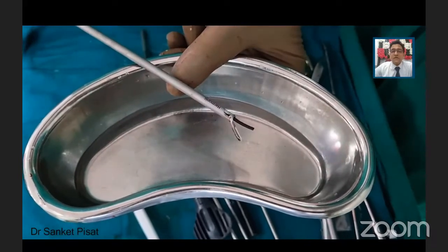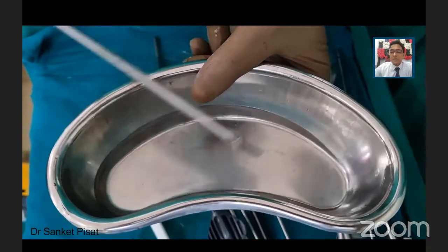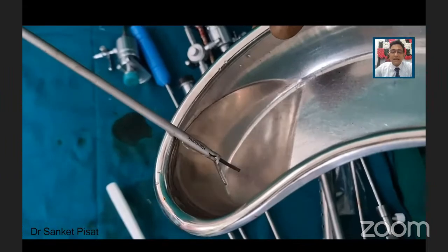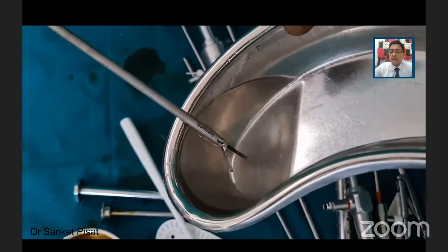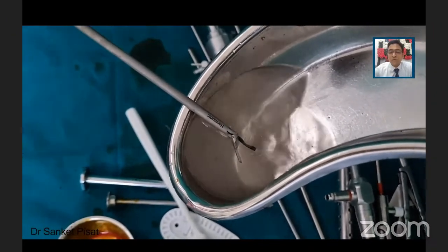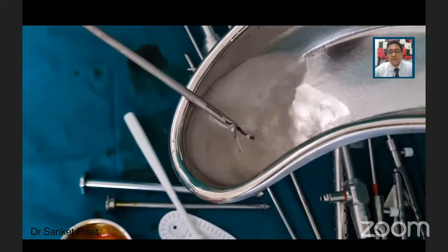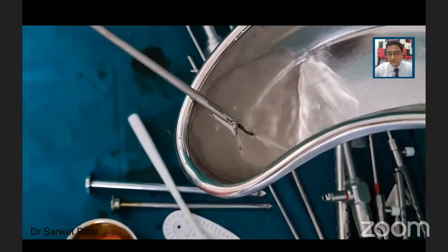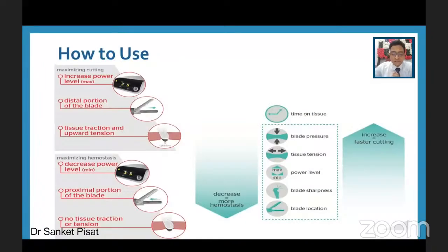Though this is not visible to the naked eye, you can see that I have started the ultrasonic scalpel, but the black blade is not seen to move. However, when this is dipped in water and the machine is activated, you can see that there is a sharp burst or a sharp jet of water which starts moving just because of the displacement, and in the maximum mode this displacement is even more, almost forming an aerosol of the liquid that is used. Incidentally, we use this for best cleaning of the instrument after the surgery.